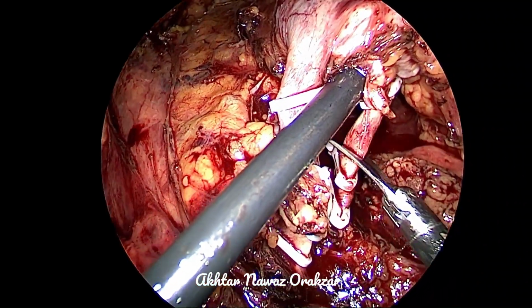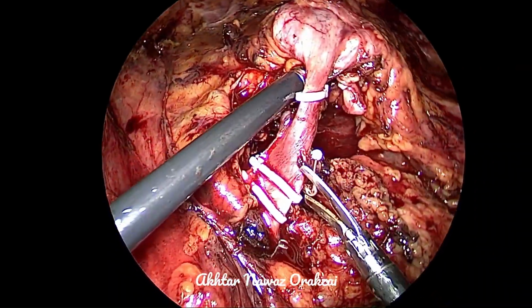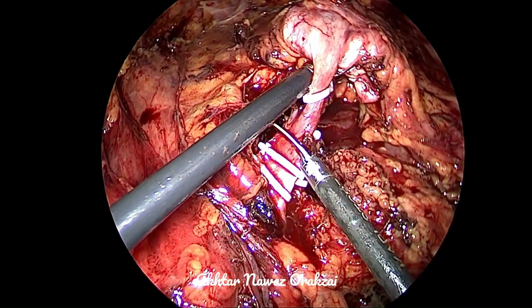Division is with the scissor and in chunks, not in one go as usual. And the same is the case with the vein.